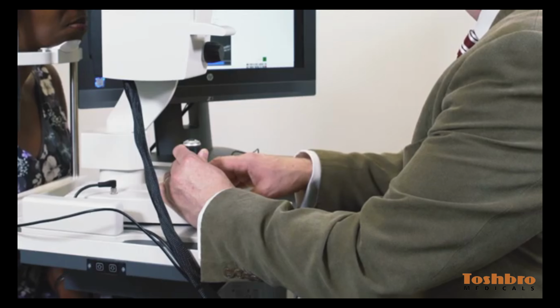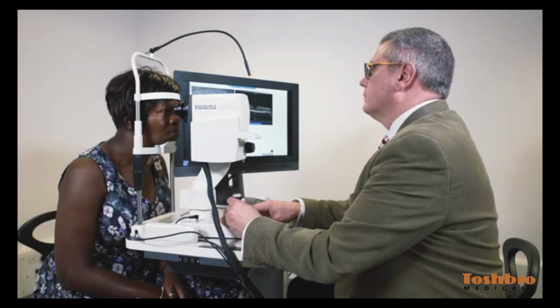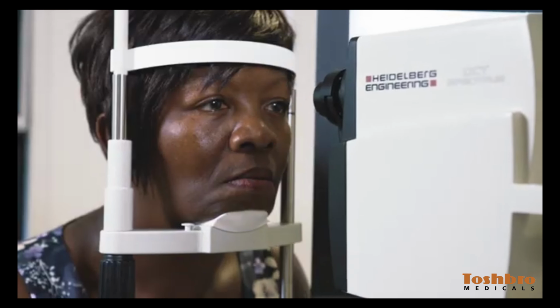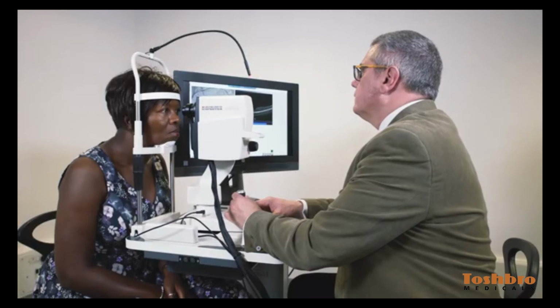You should maintain the camera position until the scan has been completed. Now move the camera head to align with the left eye and repeat the procedure for image capture.